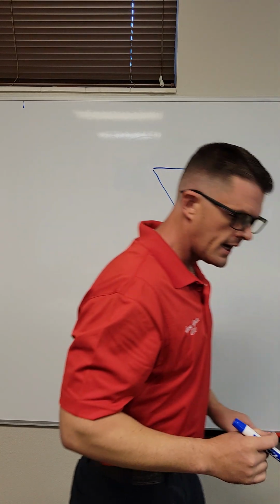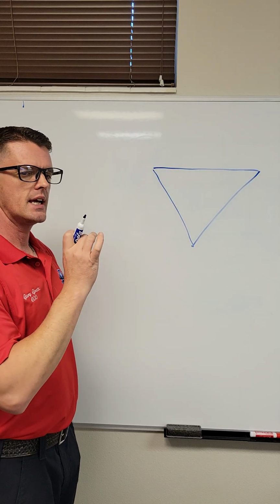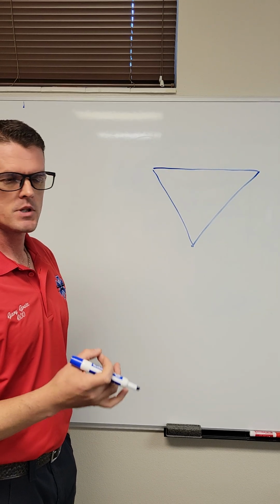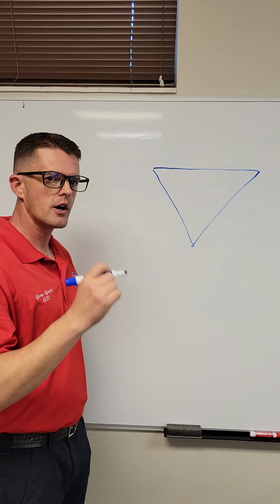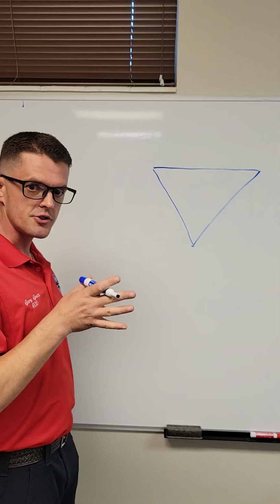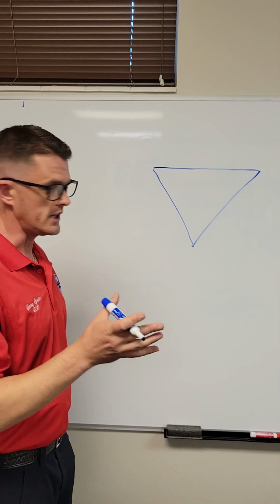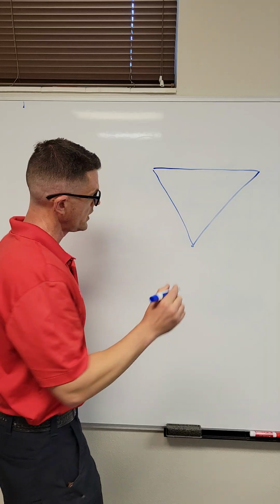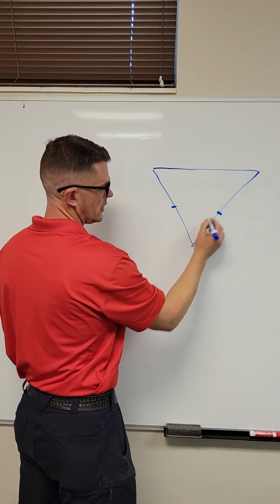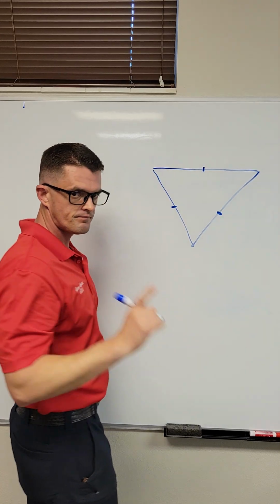And the cool thing about your monitor is now it can take measurements and give you fake leads. So what I mean is it can give you augmented, which means fake, vector, like electrical view, augmented vector leads. So what it will do is it'll take the Einthoven Triangle and split them. It'll actually figure out the exact halfway point and it will split them.